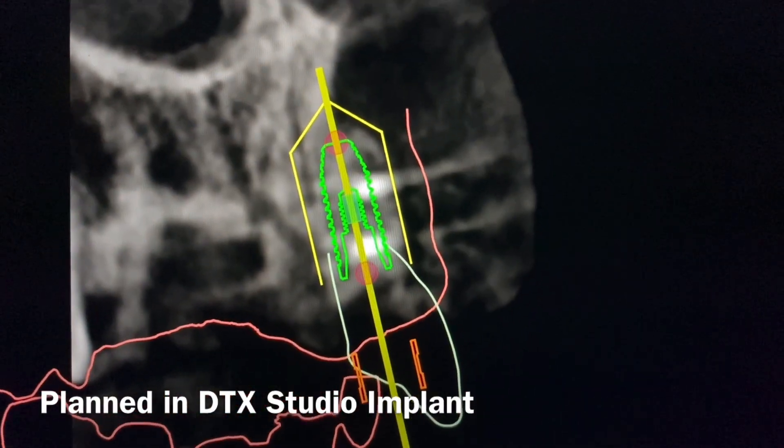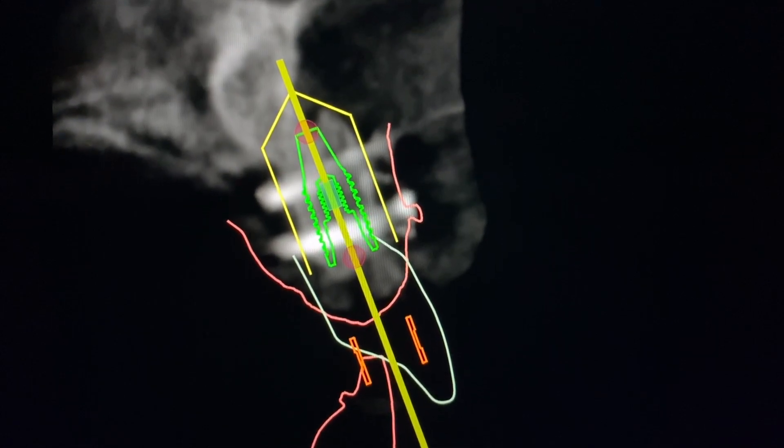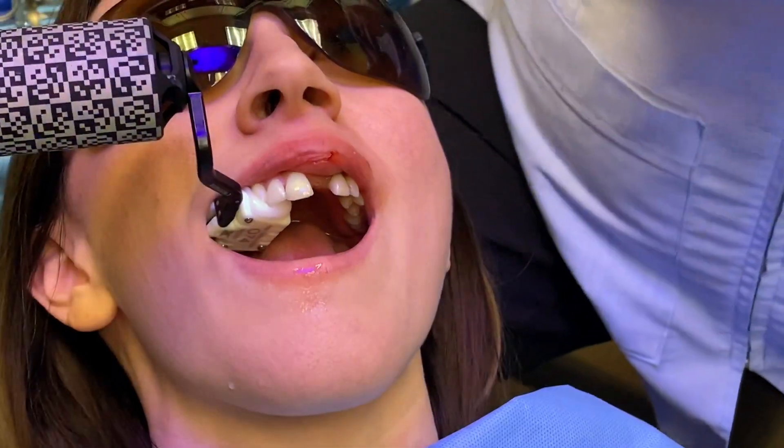you can see that we've got some thin bone here. It's been grafted, so we'll start by taking the screws out. We're going to actually do the first drill with the X-Guide.